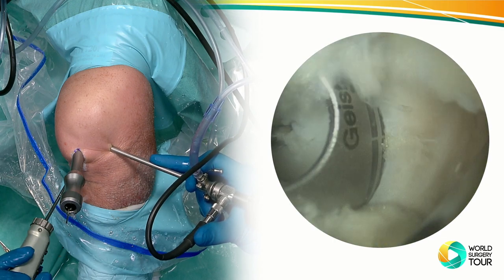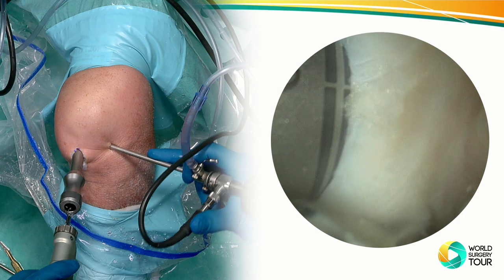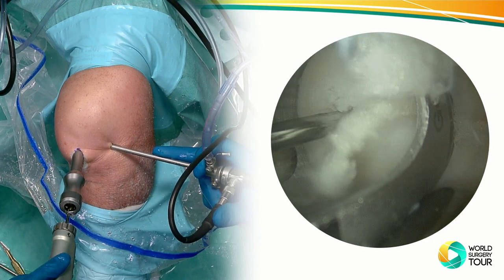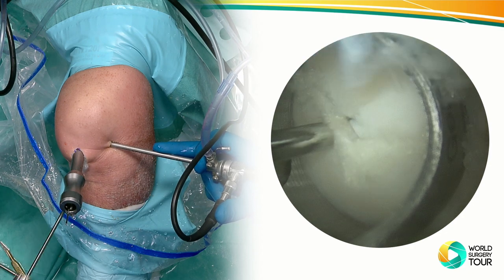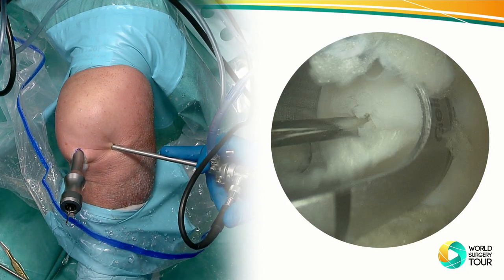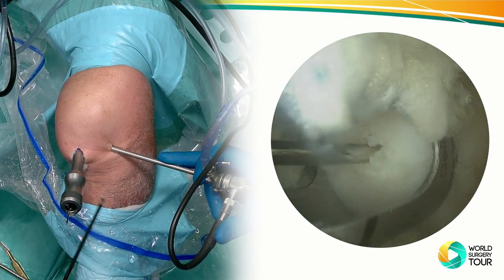So that's maybe really the most important and most difficult step of the surgery, to place the cartilage punch in the right position and to have a good view, to see the window perfectly. And that looks really nice, Sven. So now I'm happier. Do we have this HF device? Yes, the vapor.